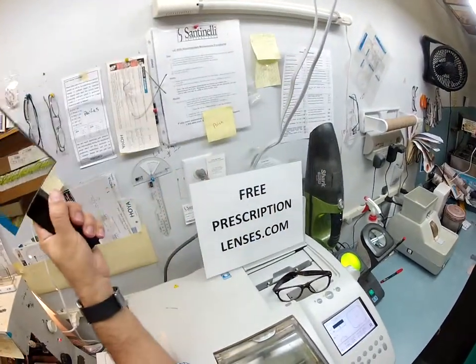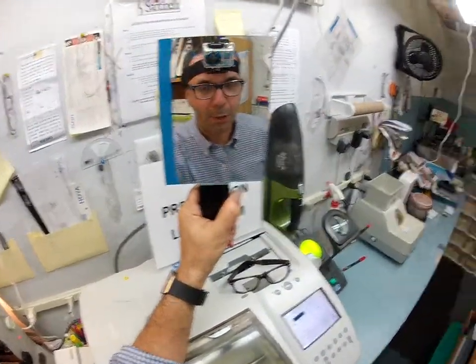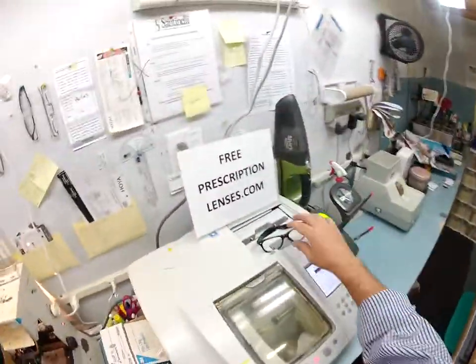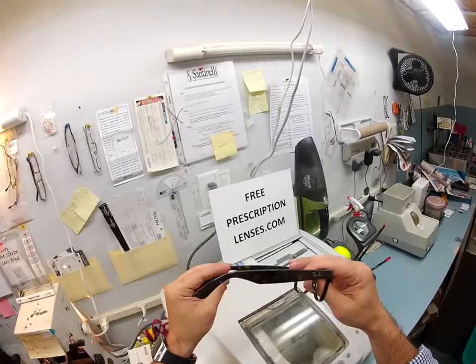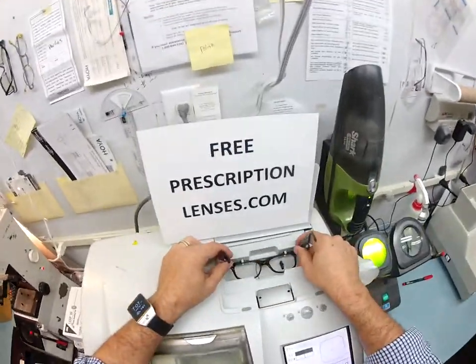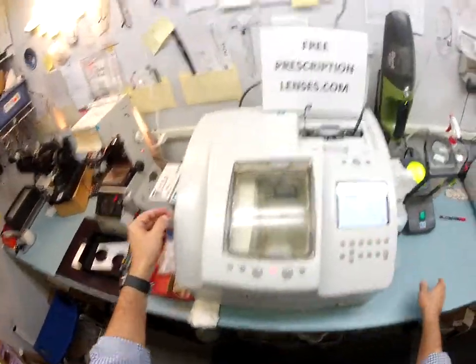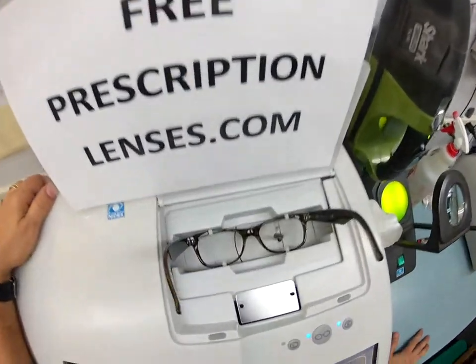Hey, Nick Matthew here with FreePrescriptionLenses.com and with the help of my GoPro camera, I'm going to show you how I cut prescription lenses for your Ray-Ban 21-32 size 52 New Wayfarer. Let's put your Italian frame into my Italian Santanelli LE1000 patternless edger.